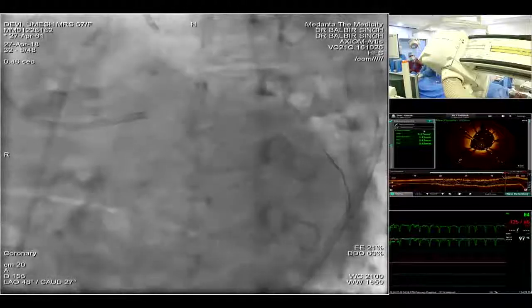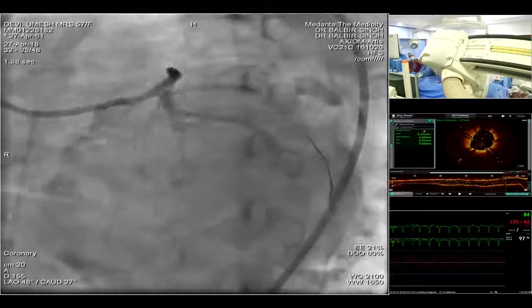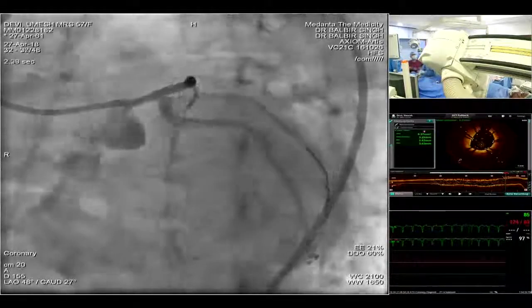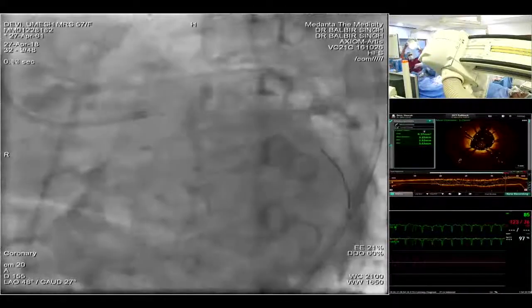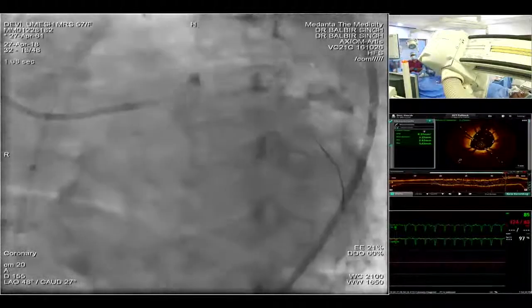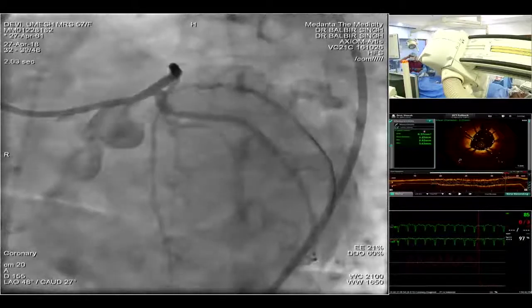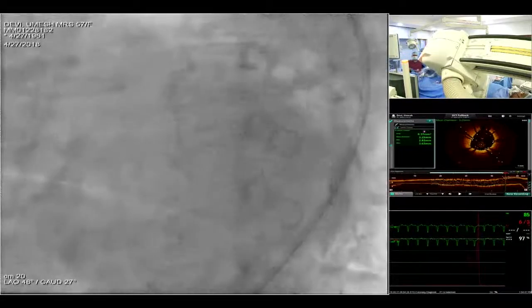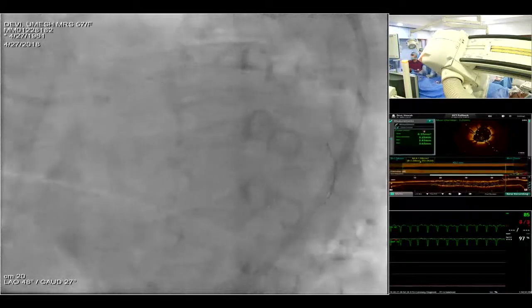Here in the panel, we notice that the left main in this projection is mildly diseased, maybe. What do you think about the left main? Yes, we saw that, and we have seen that on OCT. The first view was, we visualized it, it had a huge MLA. MLA was about 10, 9 point something. So I had looked at that and realized that, but the MLA was good and there was no plaque abutting that area.